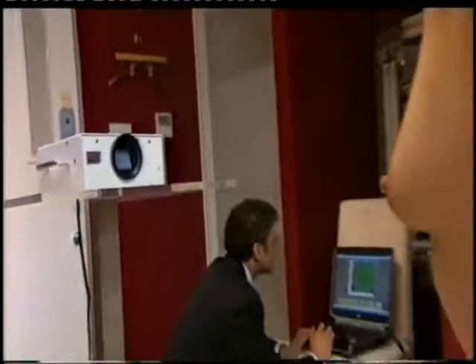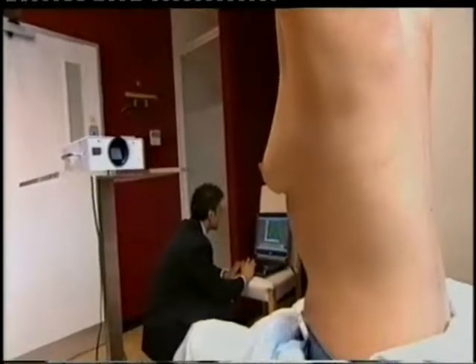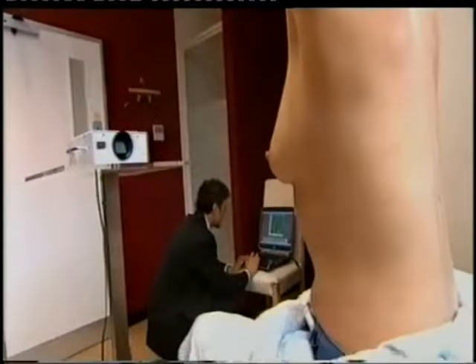We've got some shots here of it in action earlier this morning. Now this is in my dressing room. You were very kind enough to bring it in, so it's not strictly sort of medical temperatures, because it's vital that the room that you are in is of quite cool temperature. Correct. It has to be temperature controlled between 18 and 22 degrees. Yeah. And the temperature must be maintained during the scan, which takes about 15 minutes to do.